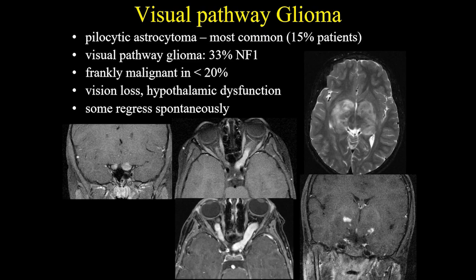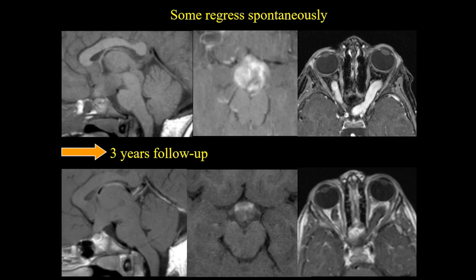Clinically, the patient can present with visual loss, hypothalamic dysfunction, and in some cases tumors can regress spontaneously. You have here a case of asymmetrical enlargement of the optic nerves with contrast enhancement and also some extension to the visual pathway on T2 and coronal T1 post-gadolinium. As I said, some gliomas can regress spontaneously — there is an example here. As you can see in the follow-up MRI studies, there is less contrast enhancement and also the lesion size is reduced.